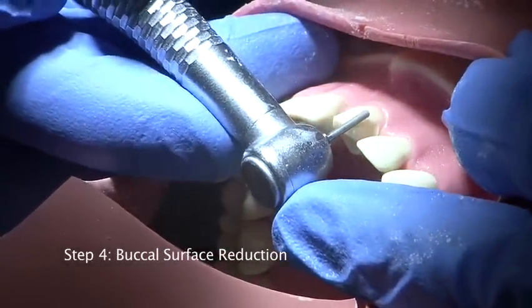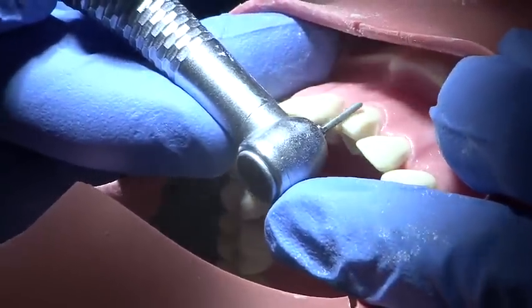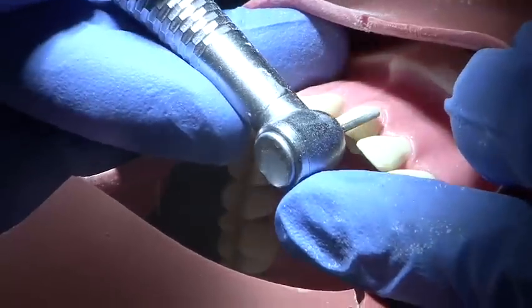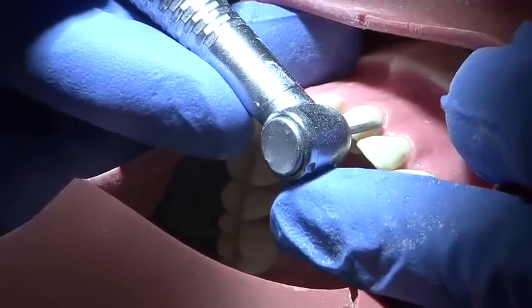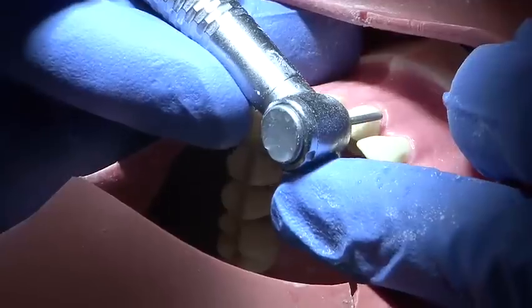The buccal surface is prepared to a depth of 1-1.5mm using a parallel sided medium grit round ended burr. Reduction is carried out in two planes to follow the natural contour of the tooth, and a smooth action supporting the burr hand will allow a nice smooth preparation.